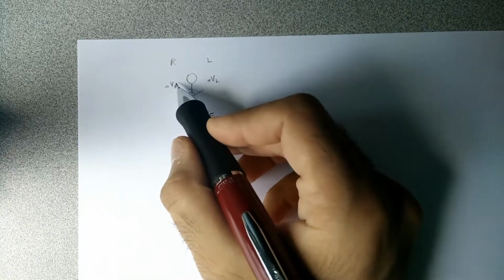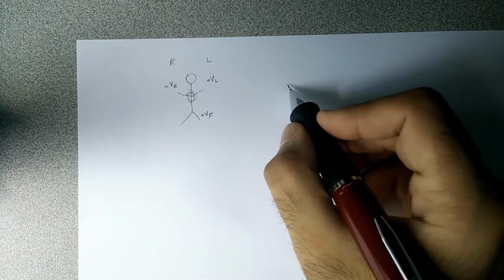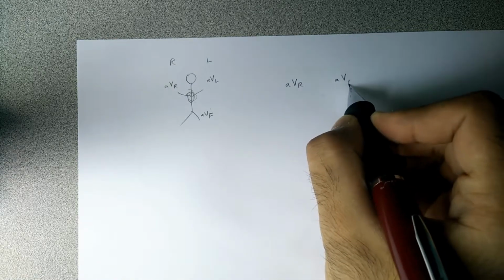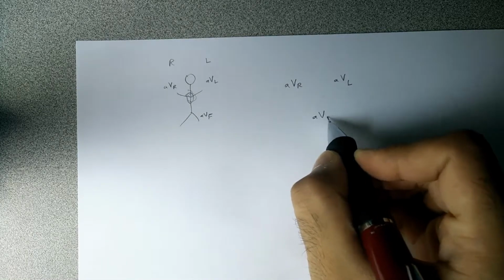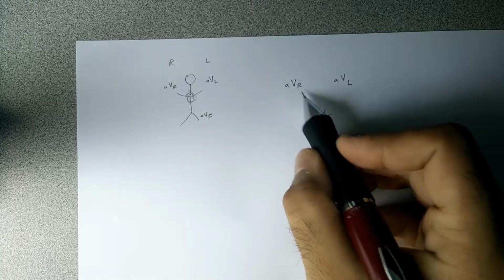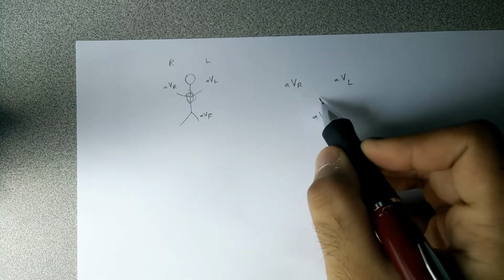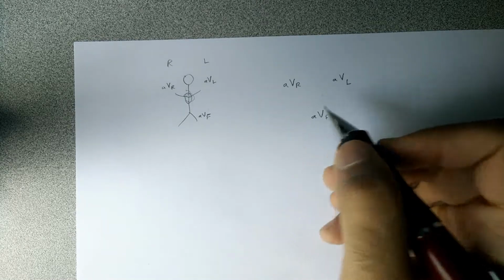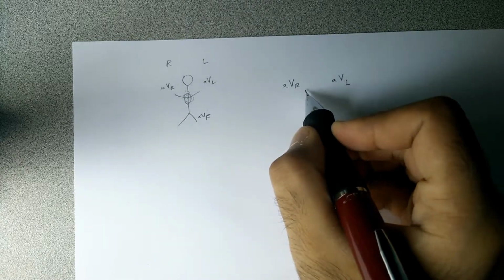If we take a look at these leads and just move them to here, we'll have AVR, AVL, AV foot. These leads by themselves will give us each direction. AVR is going to be in this direction, AVL is in this direction, AV foot is down. Now we can combine two of these leads together and make new leads.